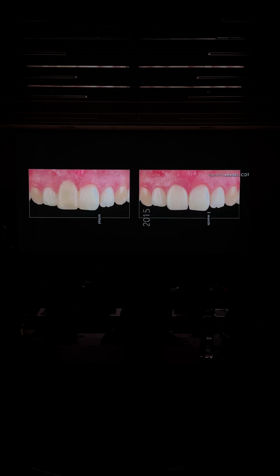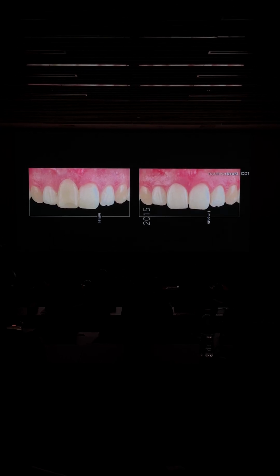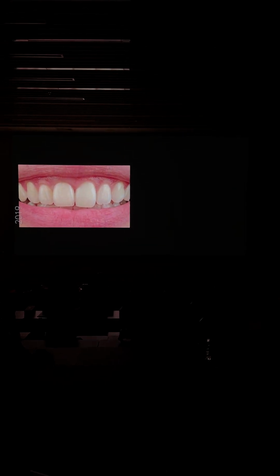This is the initial situation. You can see we usually place the bigger amount of tissue depending upon the height of the papilla we are looking for. This is about a month later, this is 2015. We wrote an article on QDT about the slim concept, and you can see all the different steps, all the prosthetic phases that we will go through in a moment, and how to deal with it. This is 4 years down the road.